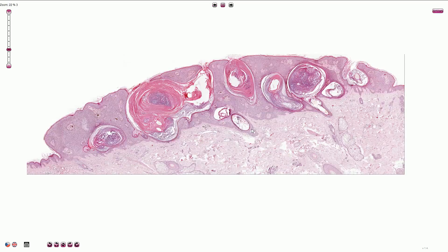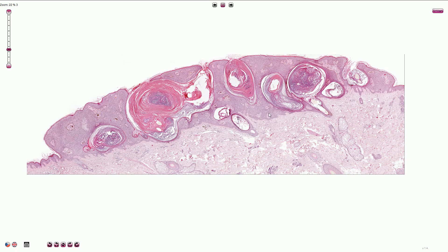Here we see the classical microscopic appearance of the most common acanthotic subtype of seborrheic keratosis. It is a superficial tumor forming an elevated papule which consists of acanthotic, slightly pigmented epidermis with multiple horn cysts. The term acanthotic epidermis means thicker epidermis — we can compare the normal thin epidermis at the border of the picture with the acanthotic thick epidermis of the tumor, which consists of anastomosing rete ridges.